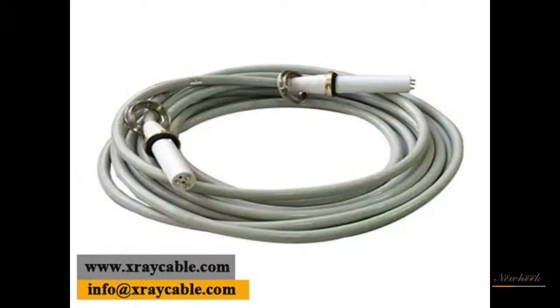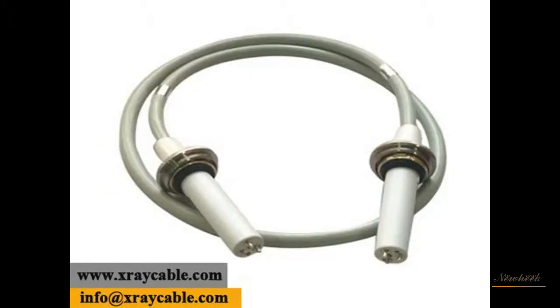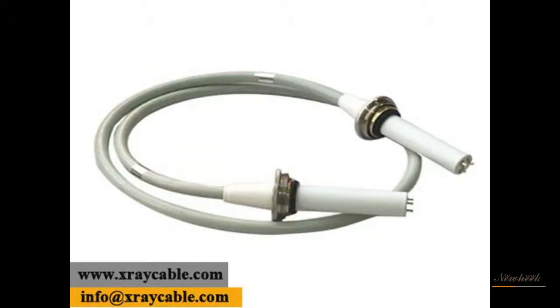High voltage fault performance differs, as different machine faults are not the same. The following phenomena will be considered as a fault of the high voltage cable part. First of all, the high voltage cable itself breaks down, which often occurs with repeated bending of the cable. Second, the high voltage plug breaks down. Third, the cable core wire opens, which occurs at the welding of the cable core wire and the high voltage plug.